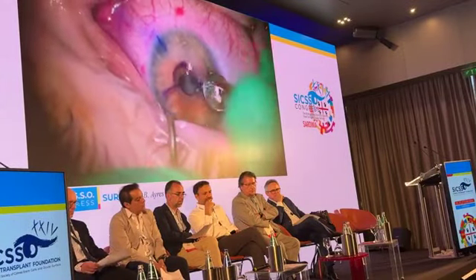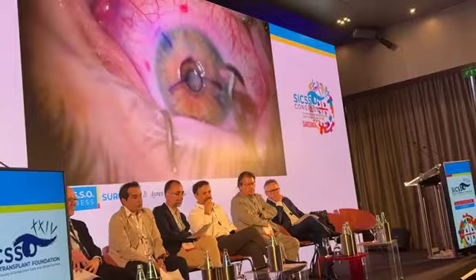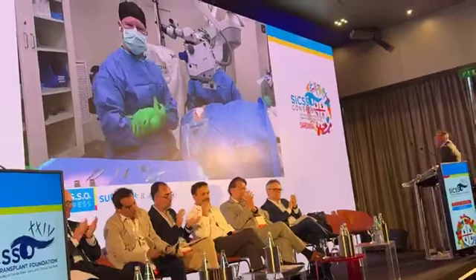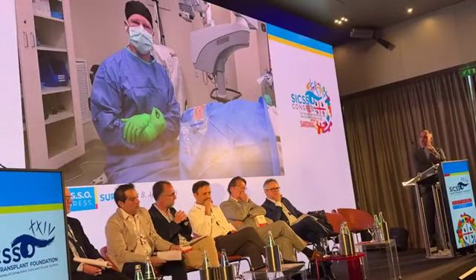All right, so guys in the audience, that is a CTAC surgery. The segment is all the way in. Hunter, how you doing down? Questions or comments while Hunter gets in the OR as we move people around? Any questions or comments or concerns, guys?